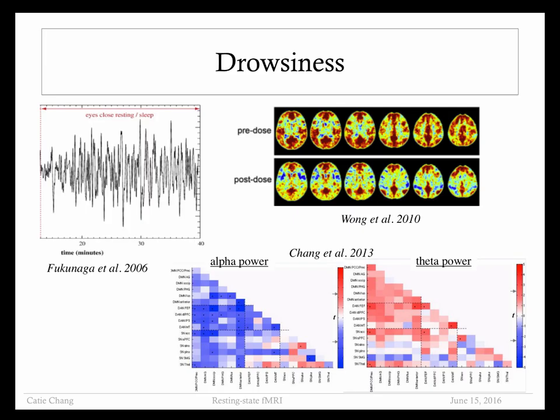collected here in Jeff Dunn's group, and they were scanning a very drowsy subject and noticed that as time went on, the resting state signal fluctuations in many different areas increased in amplitude. And so amplitude increase seems to be one thing related to drowsiness, which was shown by other studies. And also here they found that in addition, there seemed to be a widespread increase in positive correlations over the brain. Here they studied subjects before and after they were given caffeine.